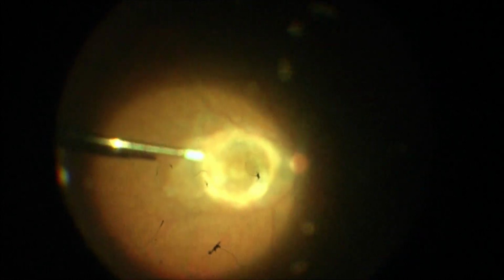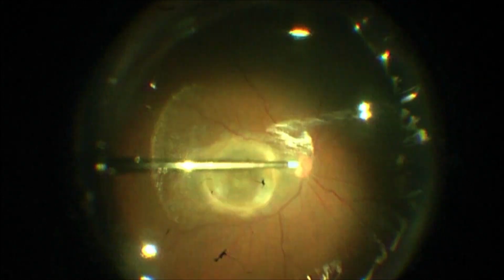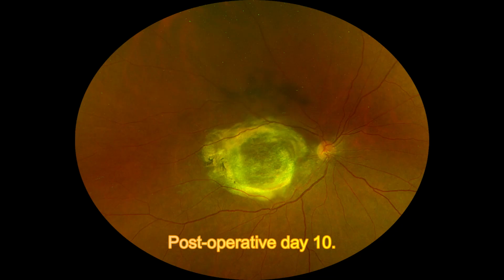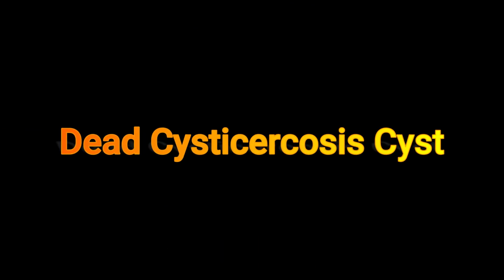Fluid air exchange was done. Laser was done to the retinotomy through which the cyst was extracted. On postoperative day 10, the patient had attached retina with macular scarring. Our second case is the left eye of the same patient.